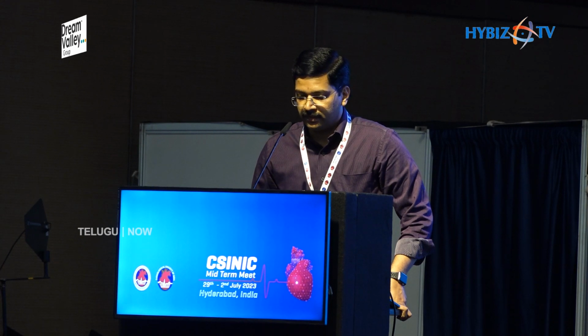Again it showed a diffuse fibrofatty plaque. We thought of using a cutting balloon. Coming to the diameters, distally it was 3.19. The tightest point was measuring 2.62 millimeters, and proximally it was 4.06 millimeters. We thought of using a 3 millimeter stent. Coming to the lesion length, measuring from the ostium up to the normal segment, it was 30 millimeters, and for the crushing, we took a 33 millimeter stent.